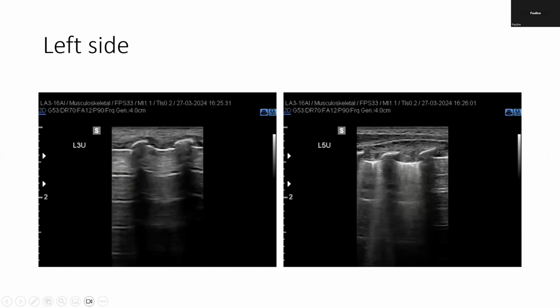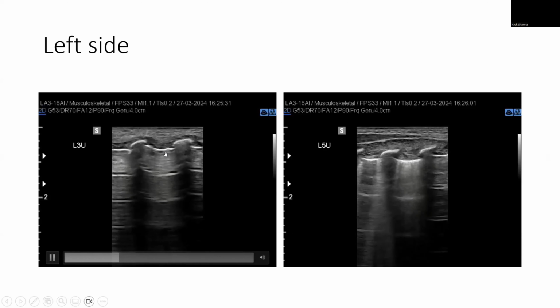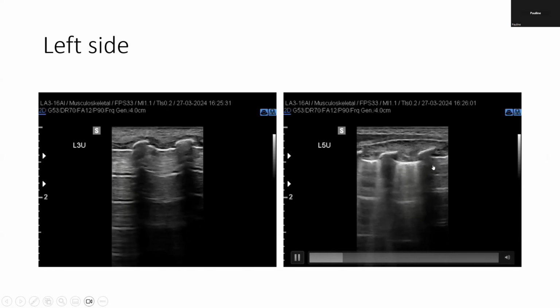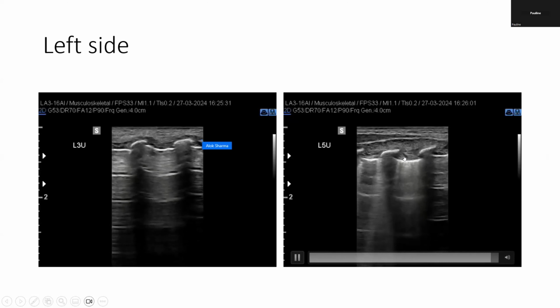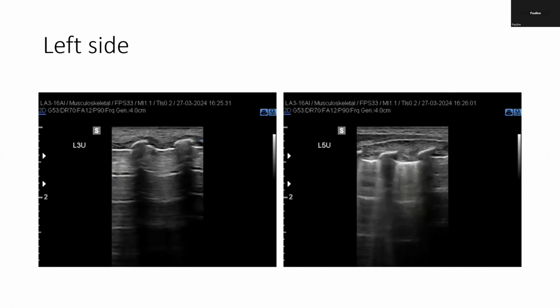And then I looked on the axillary line, and that confirmed the A-profile for me too, but on the posterior axillary line I see the pleural sliding with some A lines, but also a lot of B lines and some comet tails. And here for me, it's a double lung point, where here I see the A-profile, and here it's an A/B profile with some B lines. Yep, that was my thought.